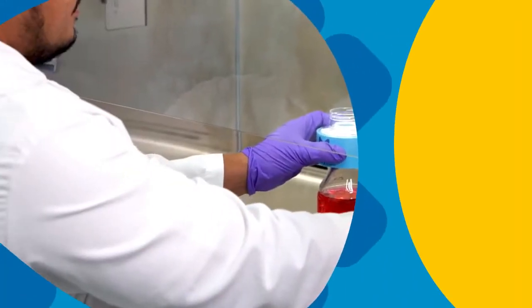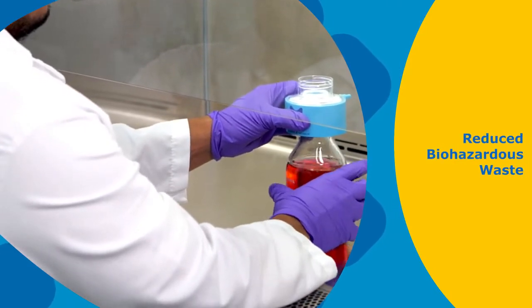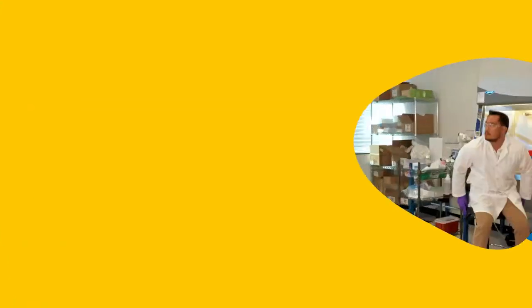The reduced environmental impact doesn't stop with reduced materials. The SteriCup E and SteriTop E devices enable a notable reduction in the volume of biohazardous waste generated by your tissue culture room. This helps many labs meet institutional waste management goals.